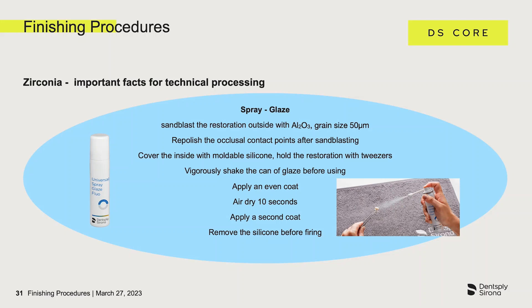The glaze spray must be thoroughly mixed by shaking the spray can for one minute. An even thin layer is applied to the surface by short, even sprays. The first coat is allowed to air dry for about 10 seconds, then a second coat is applied in the same way and also dried for 10 seconds. A slightly frosty surface remains with a glaze layer that is not too thick. The silicone is then removed from the inner surface, and the restoration is held at the proximal contacts with diamond tipped tweezers.